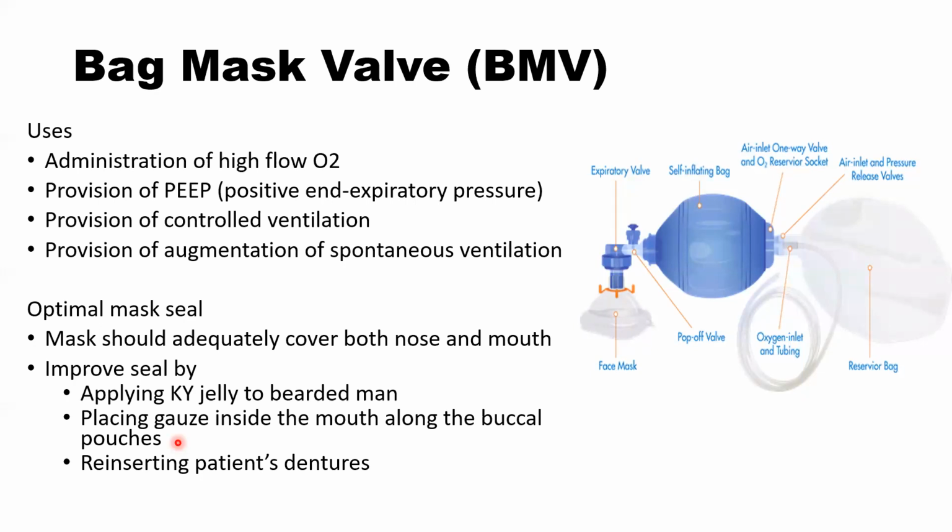The buccal area, don't insert too deep. That way you don't occlude. You put it inside the buccal area here, so that you can achieve a good tight masking.